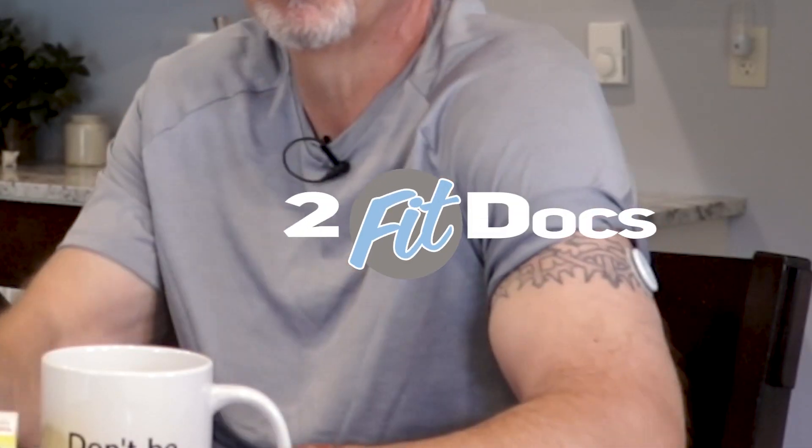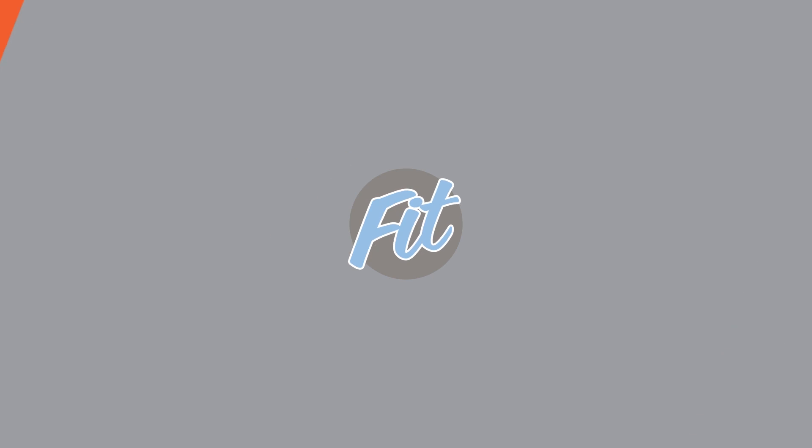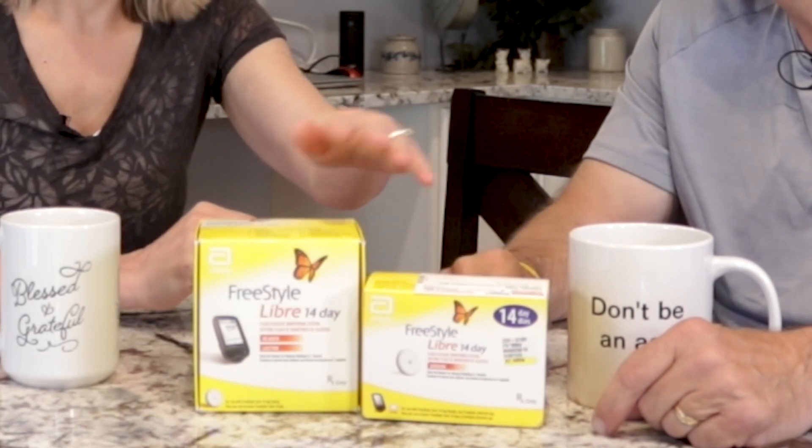Today we're going to do something a little bit different, because we are using — or I am using — a continuous glucose monitor. So we're going to talk today about the Freestyle Libre 14-Day Continuous Blood Glucose Monitor.